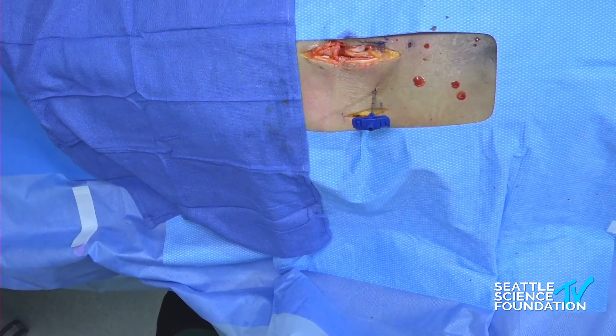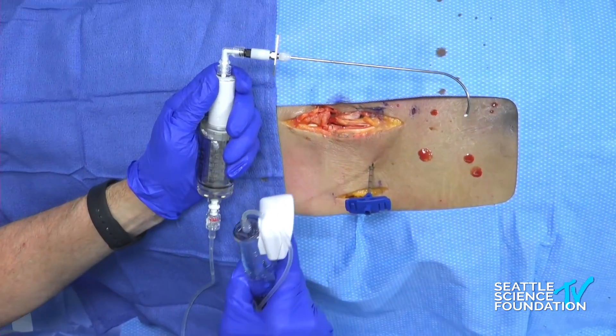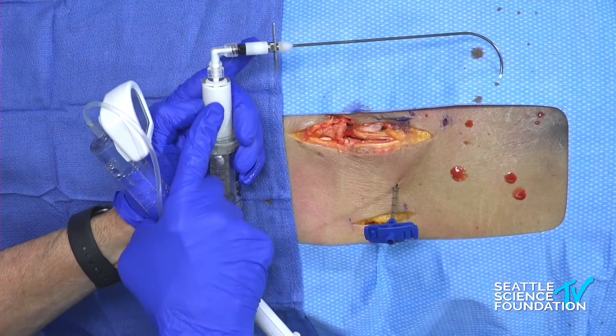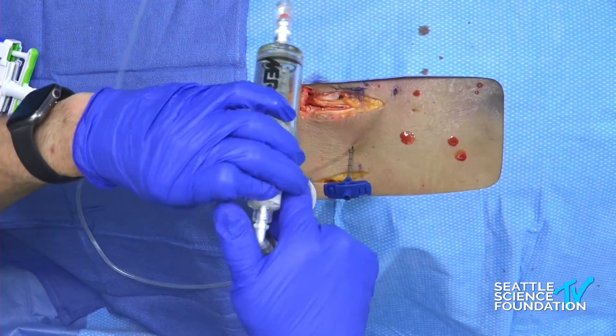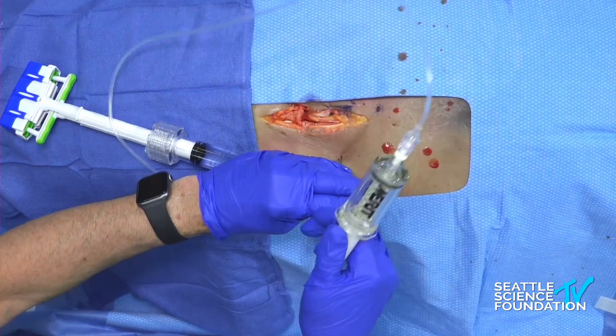This is the curved cement delivery device. As you can see, it does have a built-in curve with a directional indicator. This is the cement container here, and we will put it in following that same curve pathway and inject some cement. Because Ramsey mixed this previously, it should be ready to go.